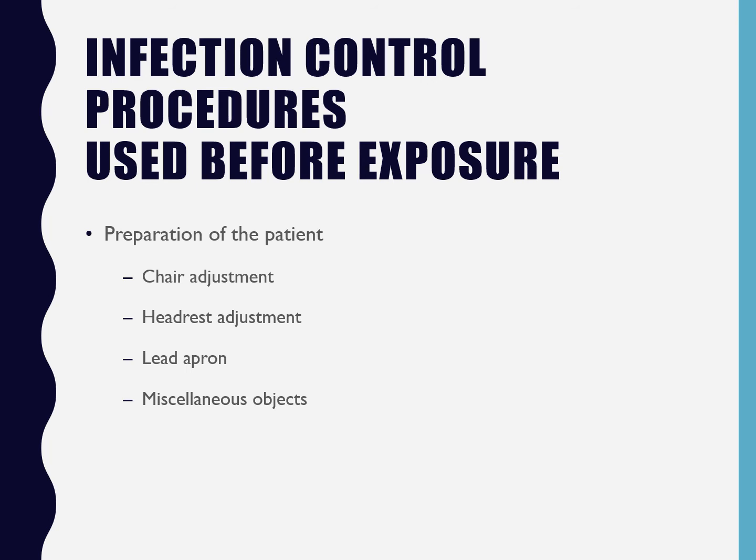That's why that little part of the chair where you step on it and pump the chair up taller is something that you do once the patient is seated, and it's something that you do with your foot. You would never reach down and touch it with your hand. I know that makes sense. No one's going to do that, but just in case. That's something that you do with your foot. That's never something that you would touch with your gloves.